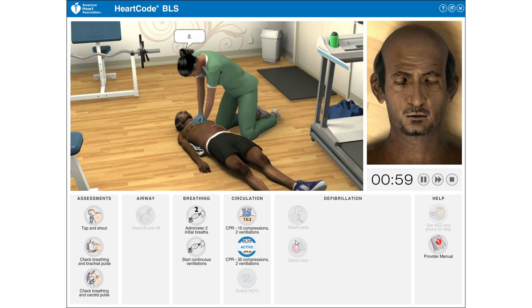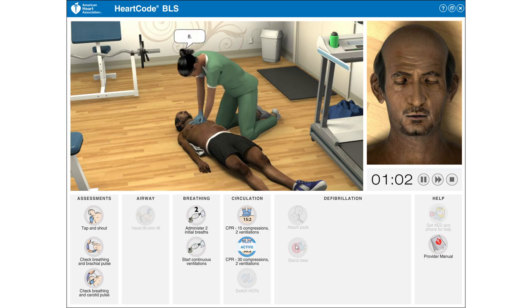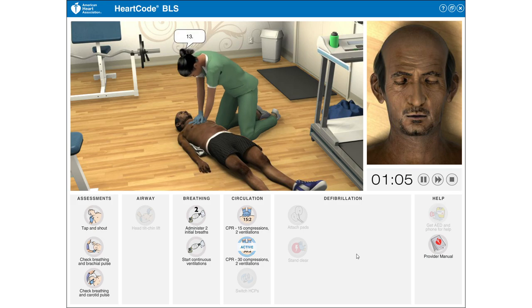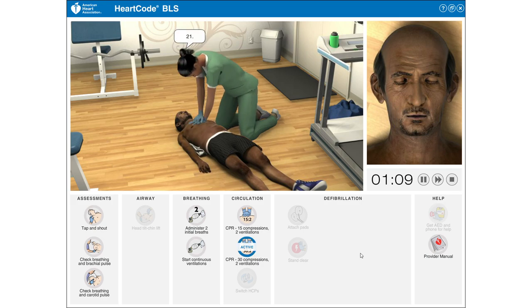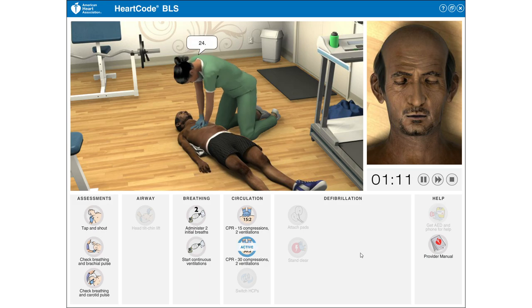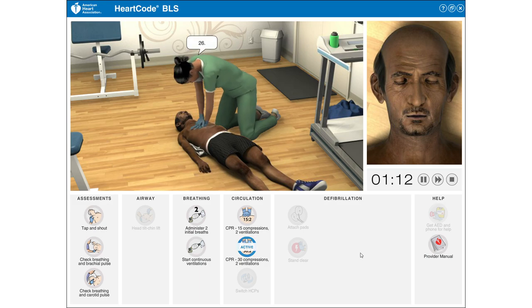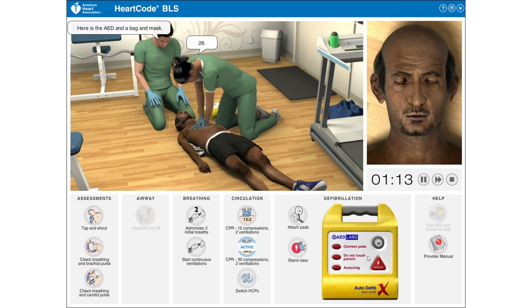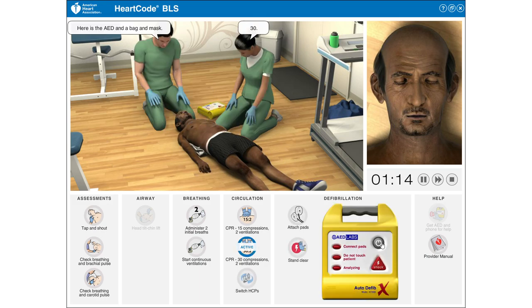Continuing chest compressions: 1, 2, 3, 4, 5, 6, 7, 8, 9, 10, 11, 12, 13, 14, 15, 16, 17, 18, 19, 20, 21, 22, 23, 24, 25, 26, 27, 28, 29, 30.